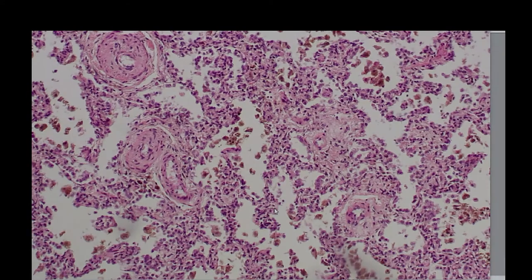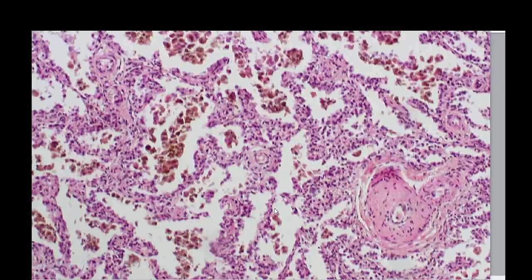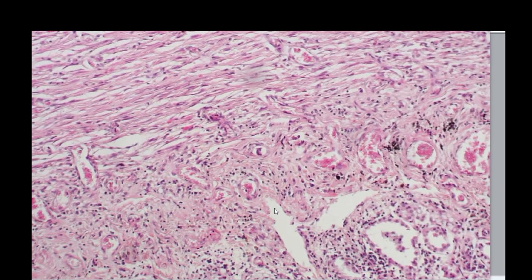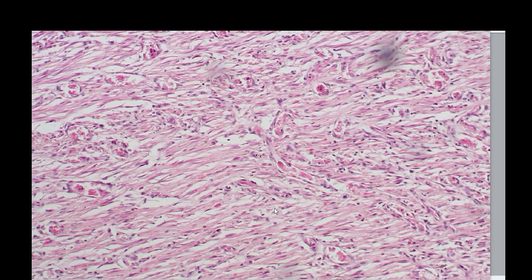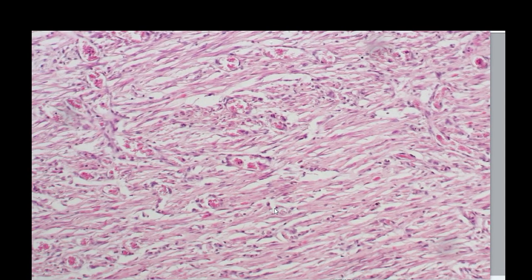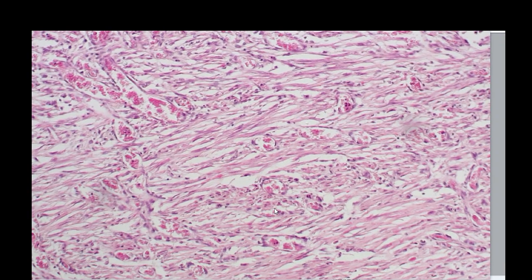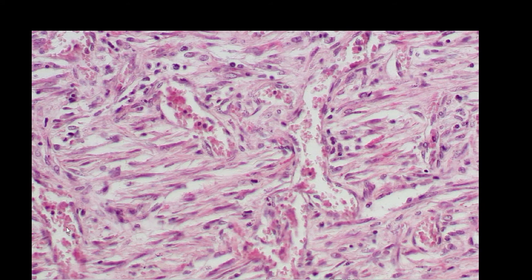Here's an example in the lung. We can see there's quite a lot of inflammation in through here. There's a lot of pigmented macrophages. And then in this area here, we've got a lot of fibrosis happening. Lots and lots of thin-walled blood vessels. You can see them branching there. And as well as that, we have lots of elongate fibroblasts present. And they are busy putting down collagen.